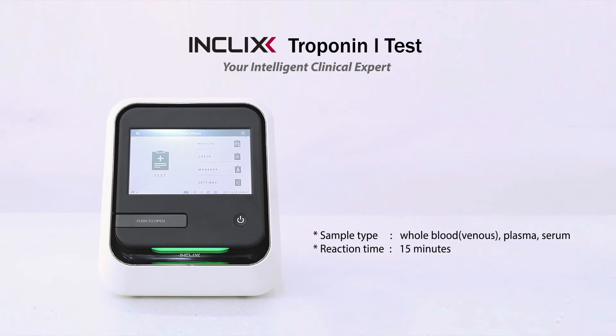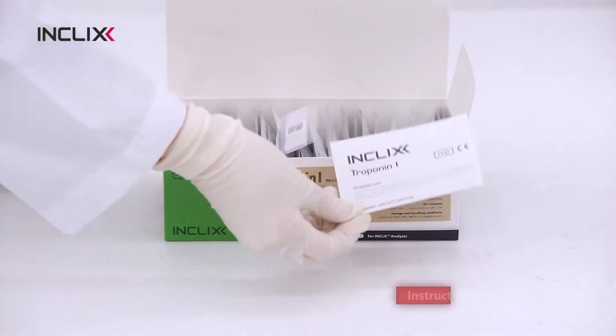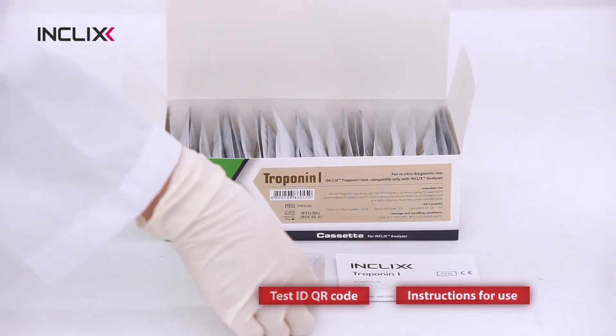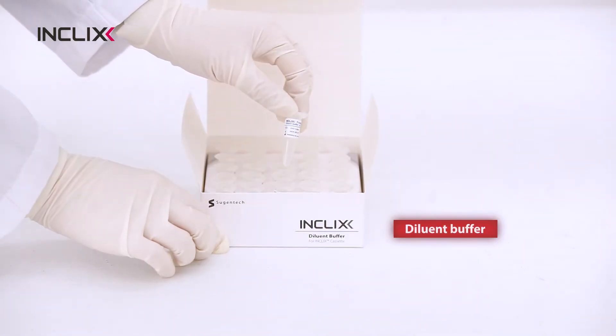INCLIX Troponin I Test. The test box contains instructions for use, test ID QR code, and test cassettes. The diluent buffer is provided separately.